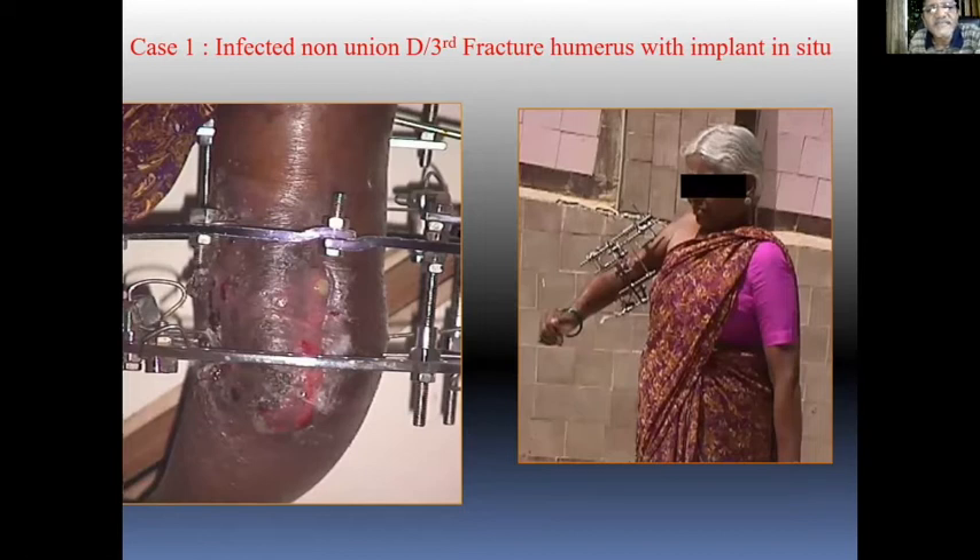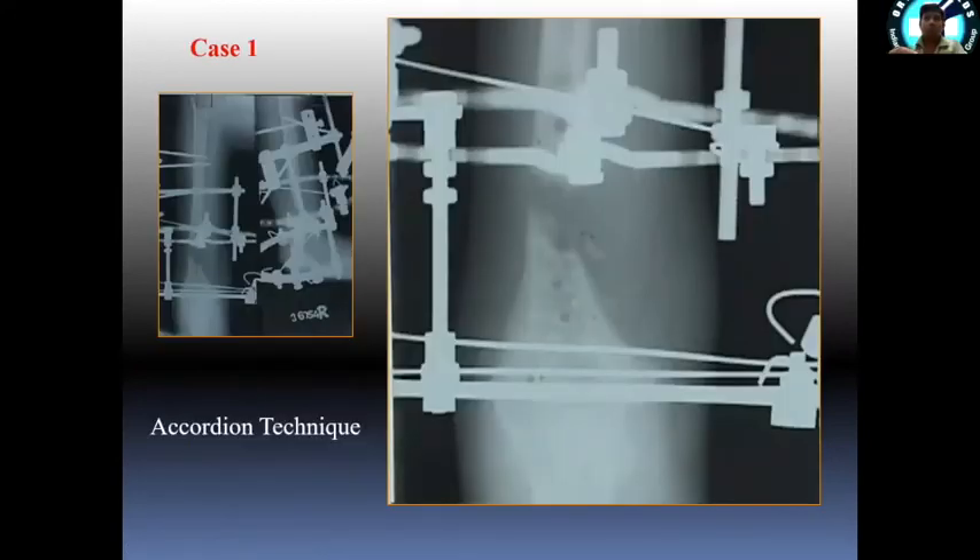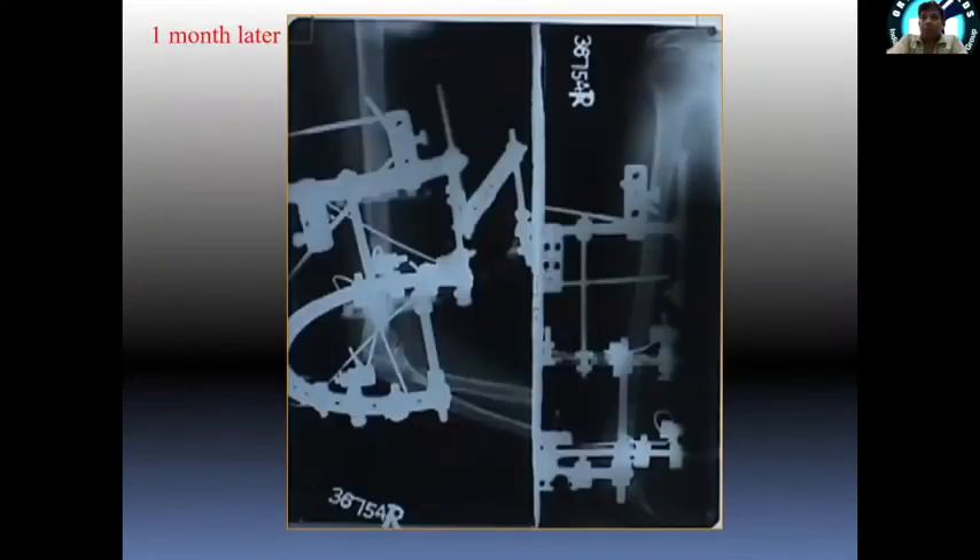The post-operative x-ray still shows some infection — you can see it very well here. There is a small sinus still present, but this lady is comfortable in different positions. Because it was not healing and that sinus was visible, I performed an accordion technique: distraction, compression, distraction, compression of this humerus fracture.